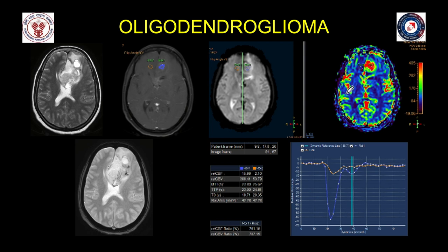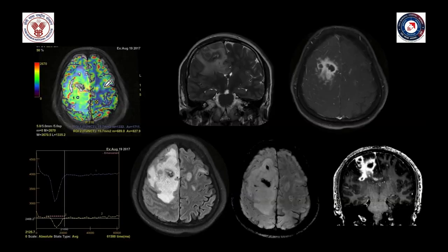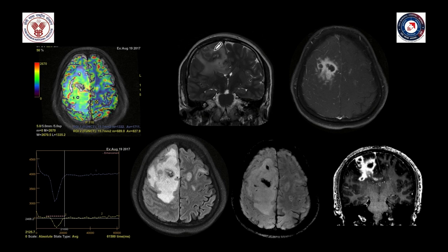Another pitfall: certain low-grade tumors like grade 2 oligodendroglioma tend to show very high perfusion values because of their characteristic 'chicken-wire' capillary architecture. Perfusion should always be used as an adjunct to conventional imaging. In this patient, the tumor involves the left frontal lobe and cortex with cortical thickening — typical of oligodendroglioma. Another unforgettable case: a frontal lobe mass with elevated rCBV of approximately 2, heterogeneous T2 signal, heterogeneous enhancement, peripheral enhancement with central necrosis, and susceptibility suggesting hemorrhage in a possible high-grade tumor.